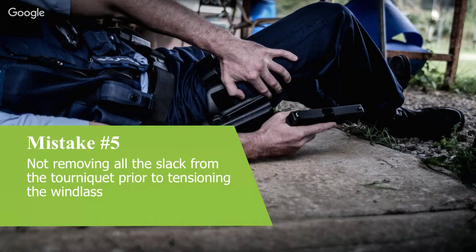There have been reports that a lot of the tourniquets placed on by medics, guys who should be trained to quite a high standard, came into field surgical teams, and up to almost 10% of those were shown to have been ineffective due to having slack. And it's easy to put on those retrospective glasses, isn't it? A lot of the time the circumstances could be a very high threat, high adrenaline situation. So it's easy to look back at a case sheet or a patient healthcare record and make these critiques. But we do know that unless you take out all of that slack, the tourniquet is just not going to be as effective.